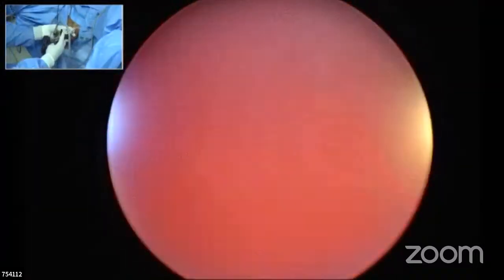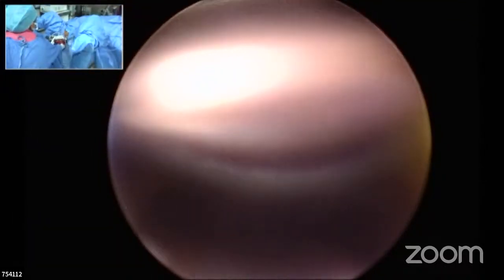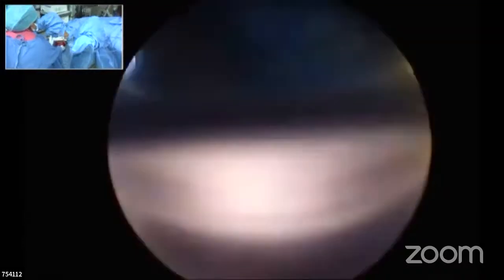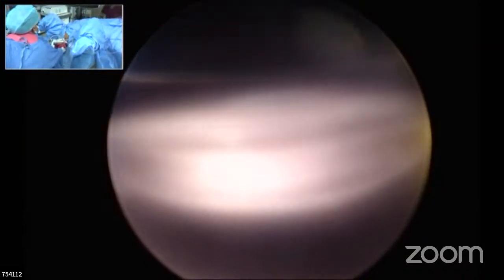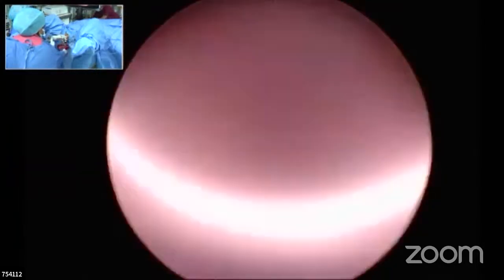Am I right, sir? Yep. That may be muscular movement, or it can be the pulsation of a deep vessel. So if you cut in that area, you may just open up the vein or the artery. Yes, sir.